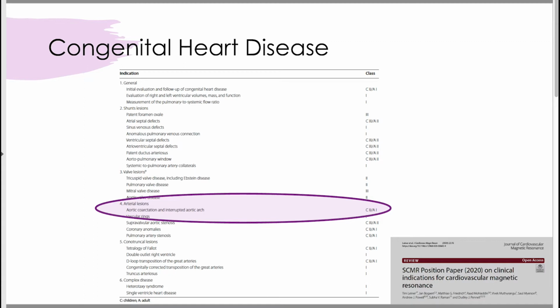You will now have available to you the quantitative and qualitative findings from case 7. In terms of the learning point, just a few things to say about aortic coarctation. Congenital abnormalities of the aorta, pulmonary arteries and coronary arteries may occur in isolation or in association with other congenital lesions. The ability to assess these structures by echocardiography becomes progressively more difficult as patients become larger, and CMR is an important non-invasive alternative.